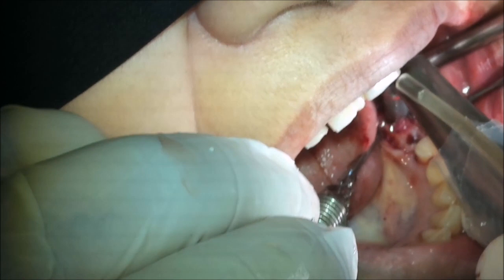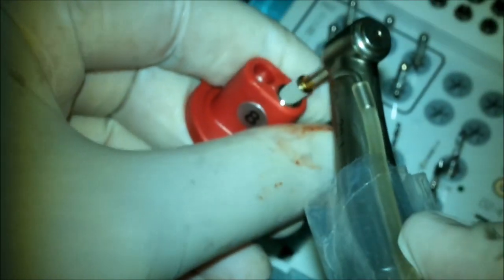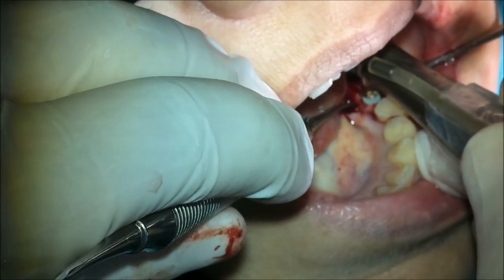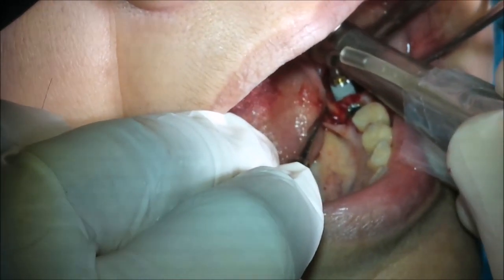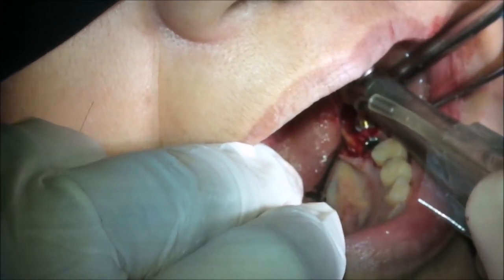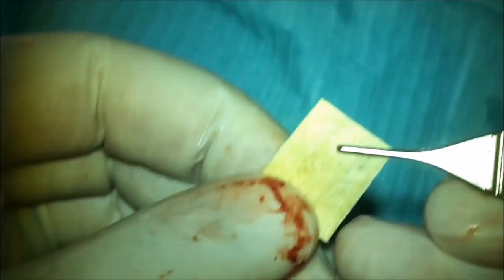In this case, we plan to put a 4 millimeter diameter implant at the site of the first molar, while we are going to use a 4.5 millimeter implant at the site of the second molar. Of course, we are going to make bone augmentation for the socket and for the bone resorption area around the second molar.